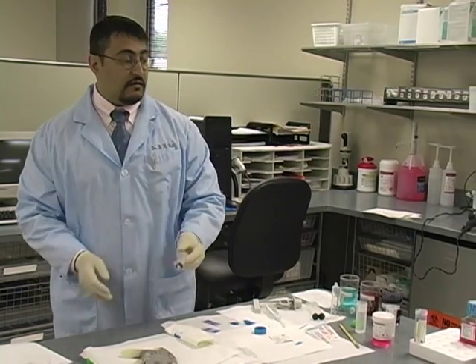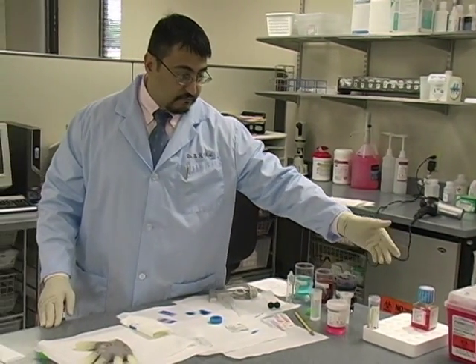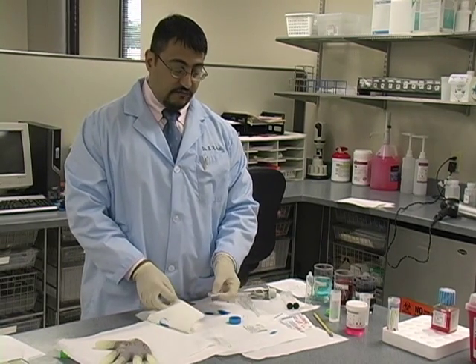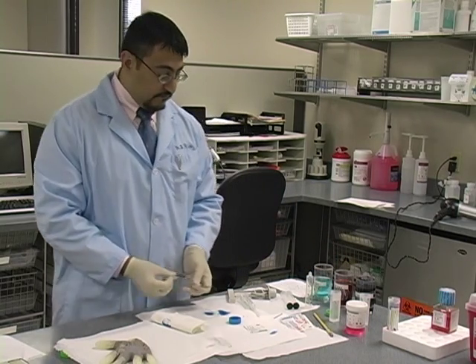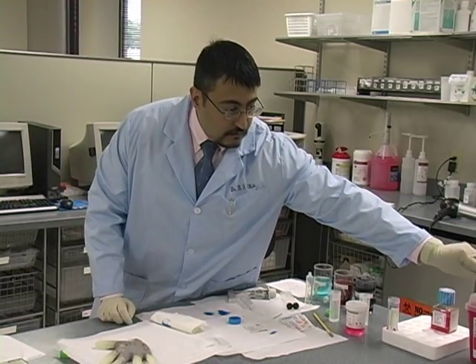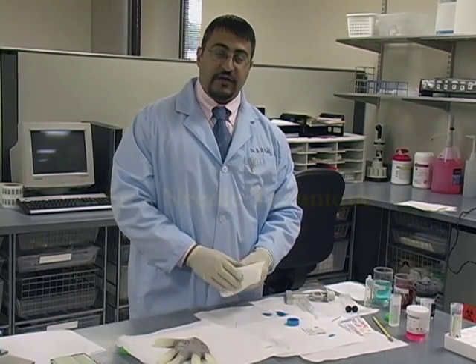After I've done that, I'm done with the syringe and needle and it goes in the sharps container. We label the patient's slides, the cyto rich red, and the RPMI with the patient's name before submitting.